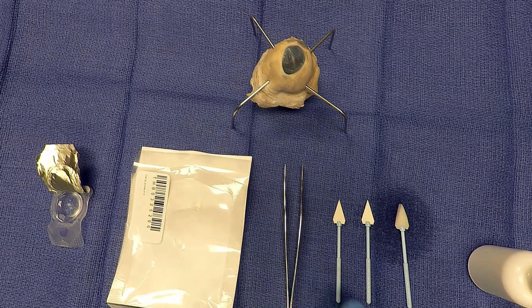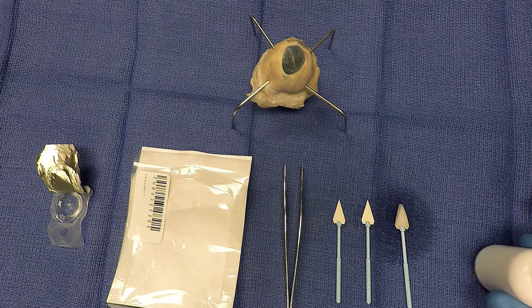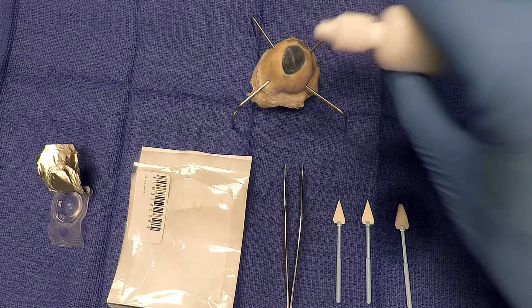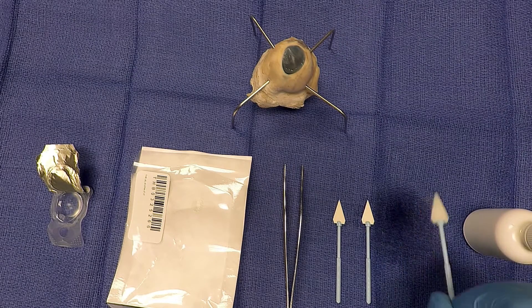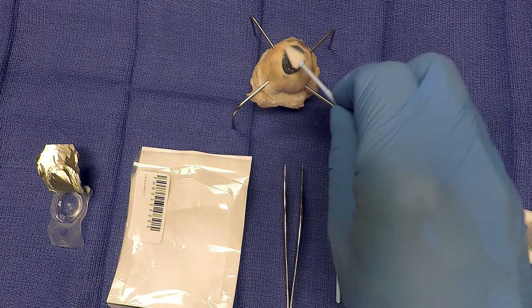First, depending on surgeon preference, a lid speculum can be used to hold the eye open, or the technician can hold it open manually while the procedure is being done. Apply the anesthetic drops after opening the eyelid. After applying the drops, have the technician or surgeon use the soft cell sponge to dry the ocular surface.